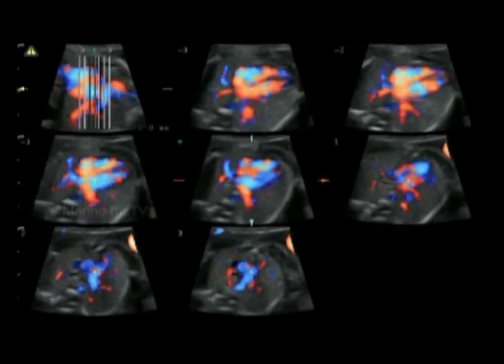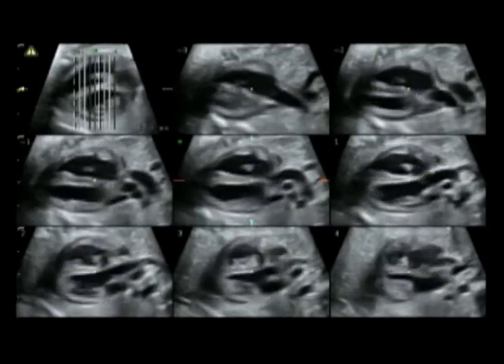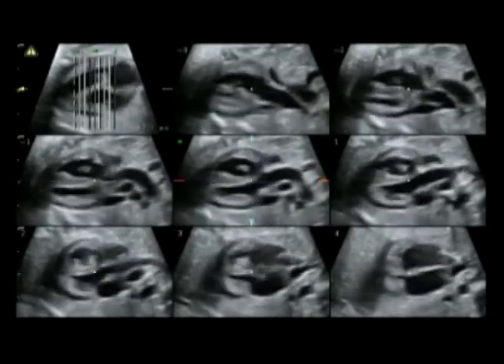This is again use of 4D ultrasound in evaluation of the heart. You can see the heart in different levels, and can evaluate the internal anatomy of the heart and the blood flow within the heart. Is there any valvular problem? Is there any hole in the heart? All this can be evaluated with this technology, much better than the 2-dimensional image.